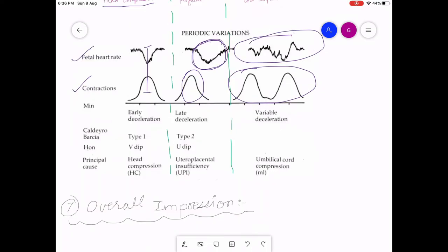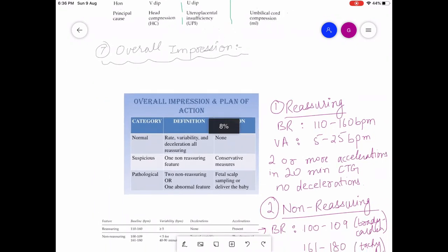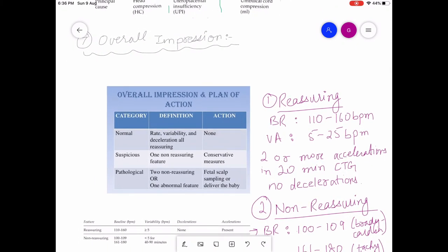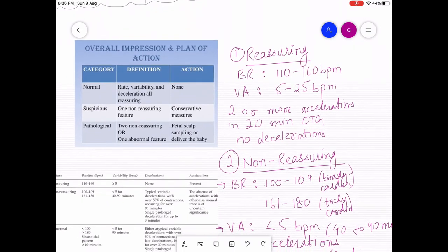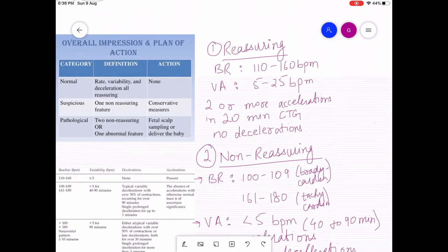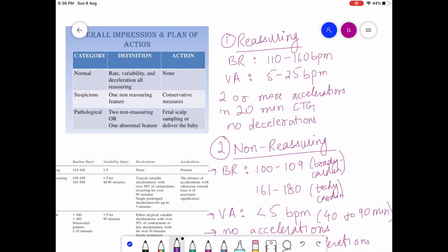The seventh point is overall impression. When commenting on a CTG strip, you need to classify it as reassuring, non-reassuring, or abnormal. Reassuring means everything is normal: baseline heart rate 110 to 160 bpm, variability 5 to 25 bpm, two or more accelerations in a 20-minute strip, and no decelerations.